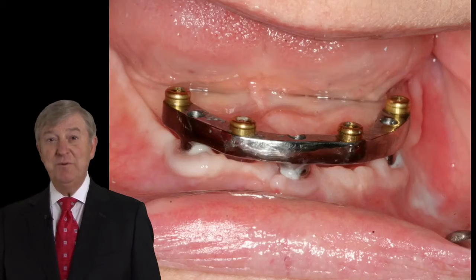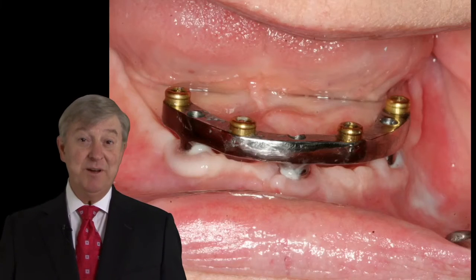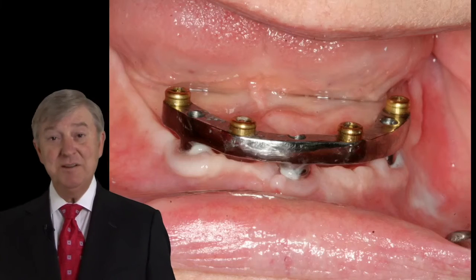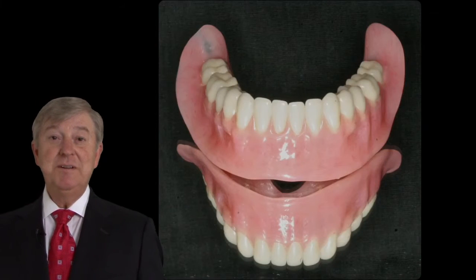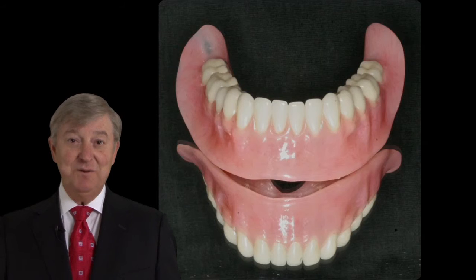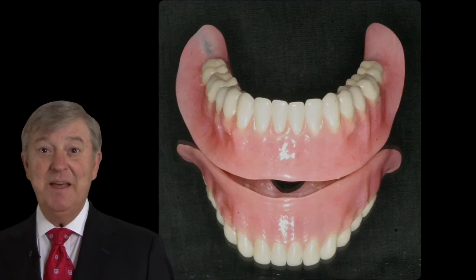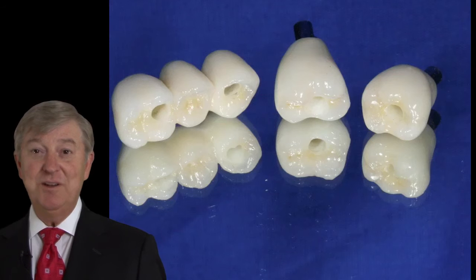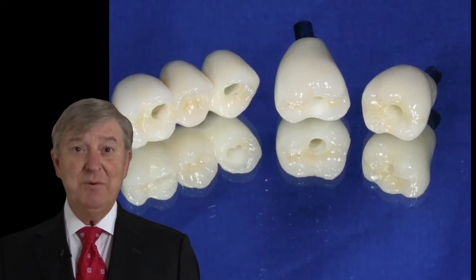We'll show the beautiful titanium bar and why it is a step up in technology, why it is an improvement over our former cast alloy technology to produce effective, successful, long-lasting overdenture therapy. And finally, we'll illustrate the use of some new framework designs for zirconia that allow us to produce strong and very aesthetic screw-retained implant fixed restorations.